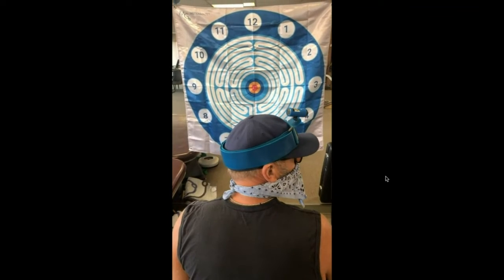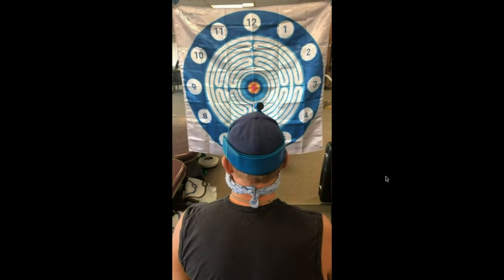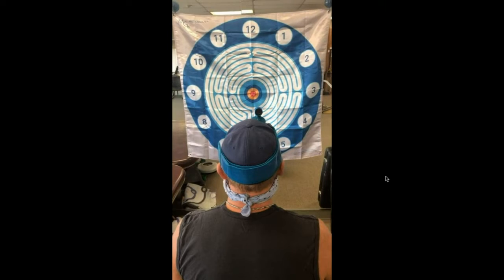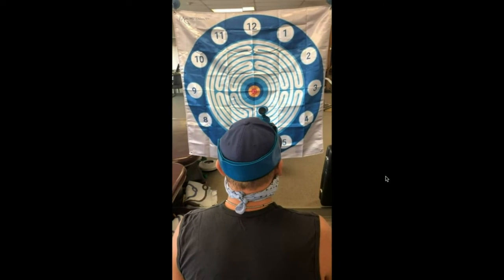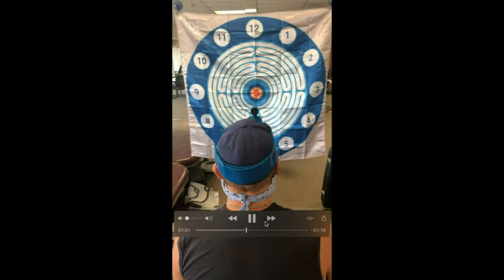So that was outside barely. He's going to do another one here. He's going to come down. He's going to overshoot again. So that's outside the standard deviation again. Let's do another one. Again, we could do up to 6. But what's going to happen here with his eyes closed? And he thought he made a correction, and he's way off again. So that's 3 out of a potential 6.